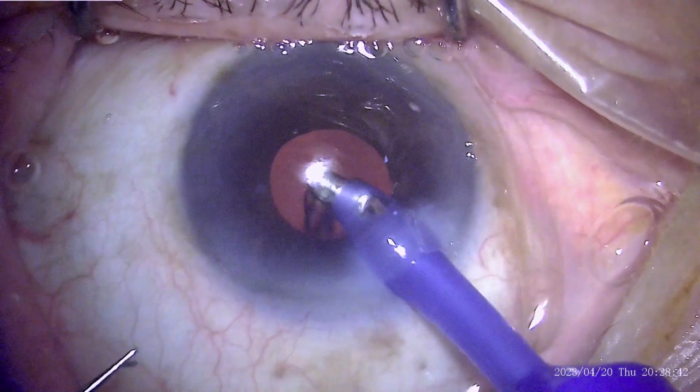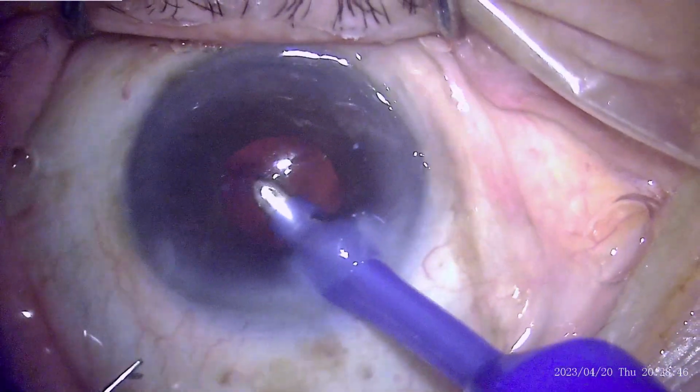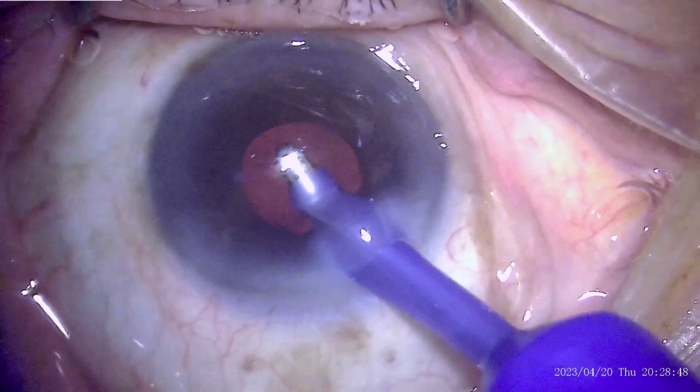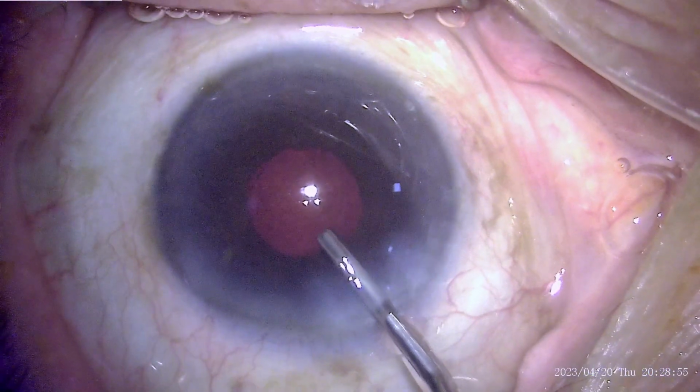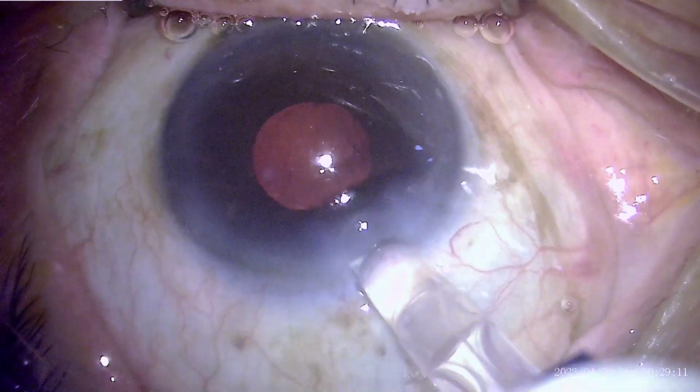This is the subincisional area, and this also has been cleaned, and then once it is determined that the cortex has been removed, it is time to implant the intraocular lens.